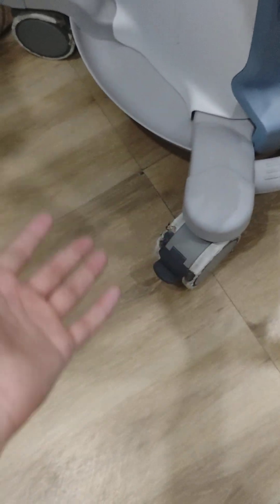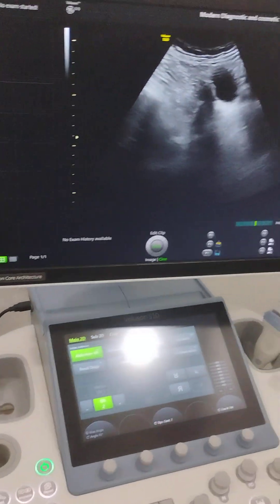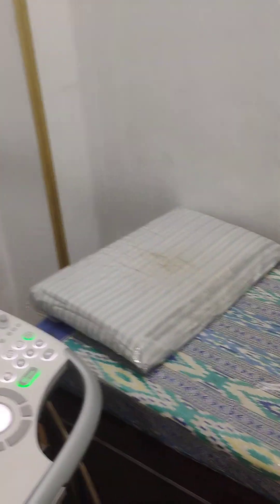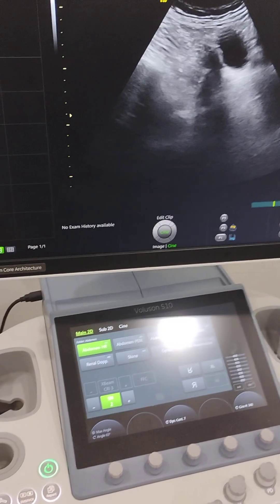There are four wheels so you can move the machine here and there. But the point to be noted and kept in mind is that in order to move the machine from this room to that room, you will first have to take the permission of the chief medical officers.